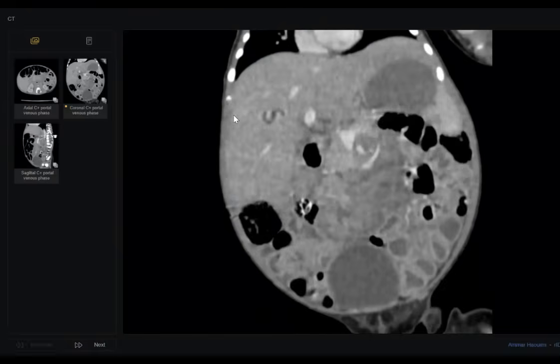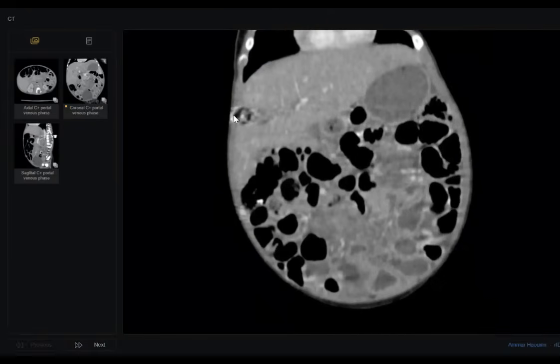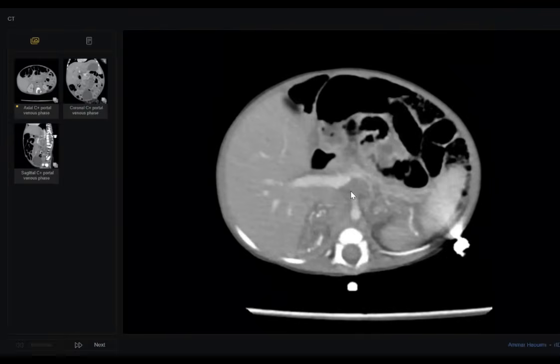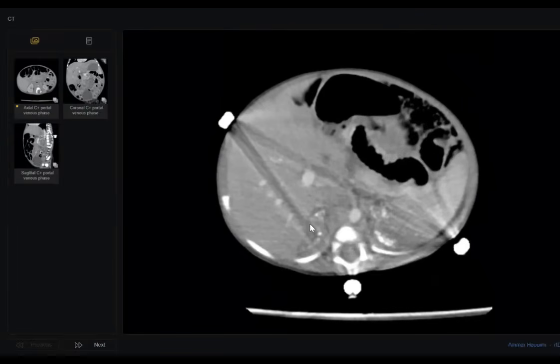Differential diagnosis. As you mentioned, we should exclude other causes of bilateral suprarenal or adrenal gland calcification, like neuroblastoma. So we must ask the patient about any history of catecholamines lab investigation, and other symptoms of increased catecholamines, like sweating and hypertension. No history.